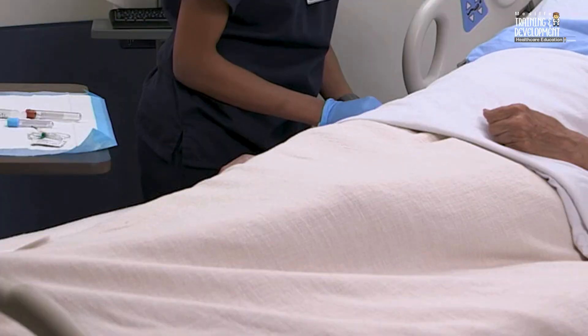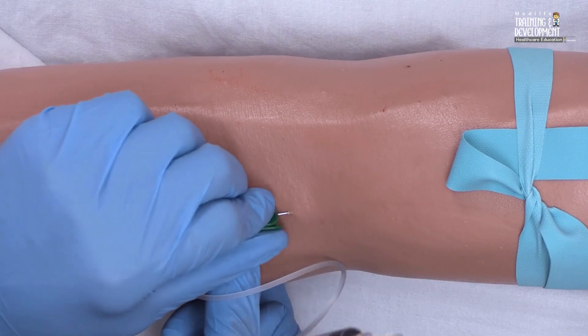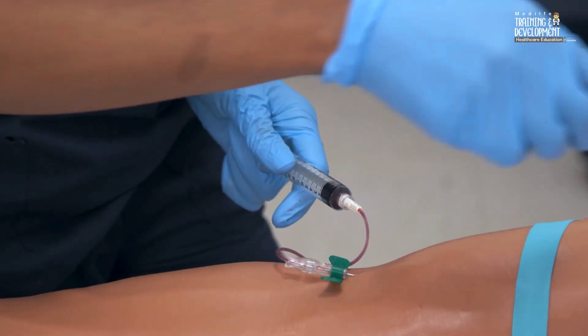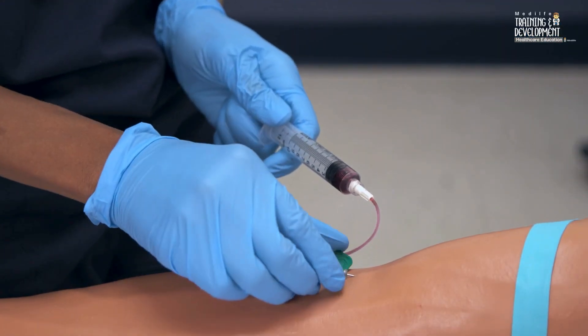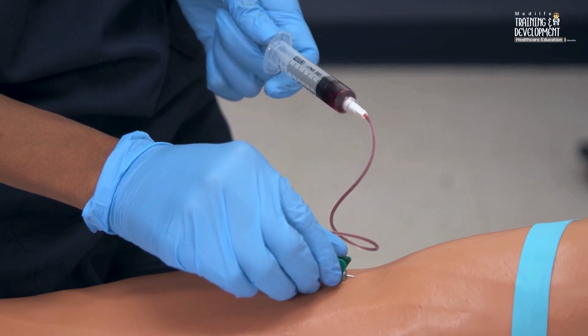Insert the needle into the vein. If you're using a syringe, venous blood will appear in the hub. Withdraw the blood slowly, pulling the plunger of the syringe gently to create steady suction until you obtain the required sample. Pulling the plunger too forcibly will cause the vein to collapse.